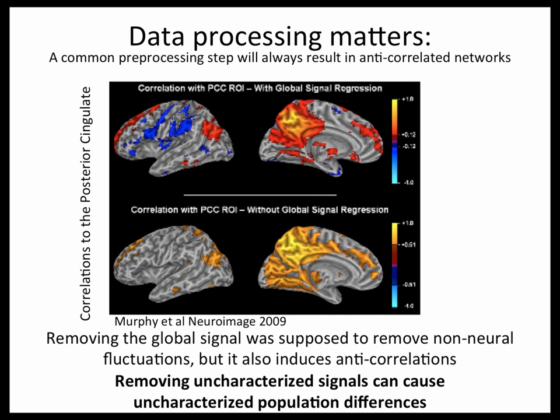And what I recommend, if you want to account for this, is to look at the correlation maps of your noise time series. If you're regressing out something like global signal or CSF or white matter, you can actually look at the correlation map of your CSF signal to the whole brain. And if there is a population bias in that, that's a big red warning flag for what you're doing next. So it's a nice thing you can at least gain more awareness of, if it's a problem in your specific data set, to give you more confidence that your findings are neural.